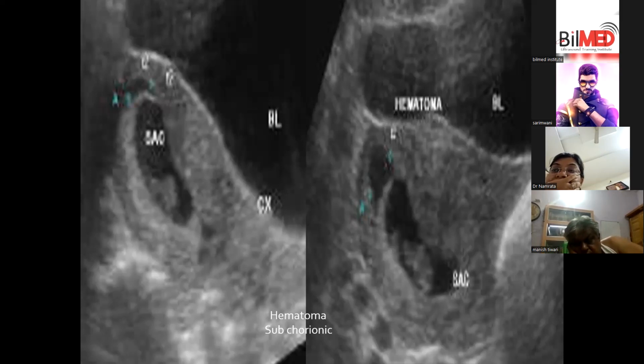So the important point is that not only you have to label that I am dealing with the detachment of this much cc, 20 cc, 40 cc, 2 cc. No, volume is important, but what I am trying to say is that more important is the location.